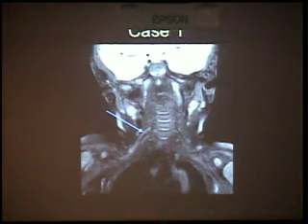And the right side, the affected side, was a little bit brighter than the opposite side. And upon more clinical history, not only was it a fall, this actually turned out to be a sad case of abuse where the parent threw the kid off the bed, and being a small kid, his head is still proportionally large, and he ended up having a stretch injury.